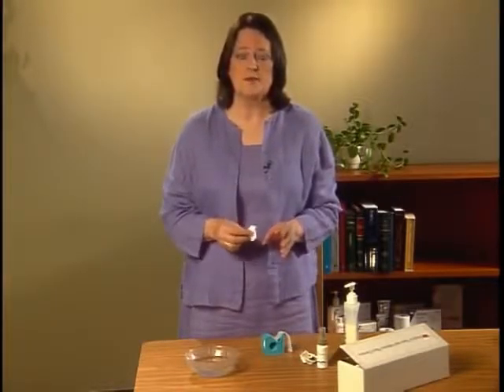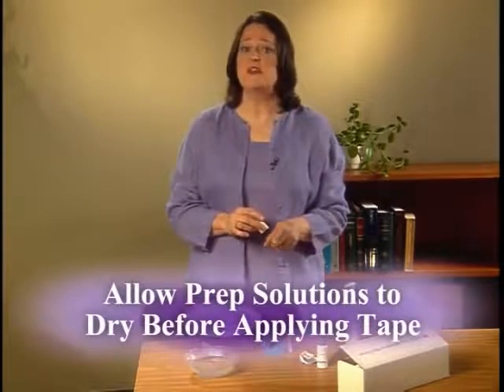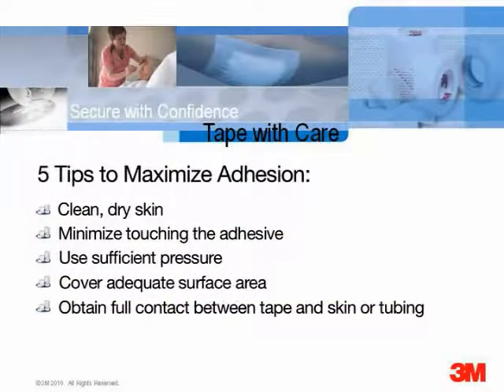An alcohol wipe may also be used to remove excess oil, but since it is very drying it should be used with care to protect at-risk skin. Cavilon no-sting barrier film may be used under the tape. If you are using a prep solution, let it dry completely before applying tape to maximize adhesion.